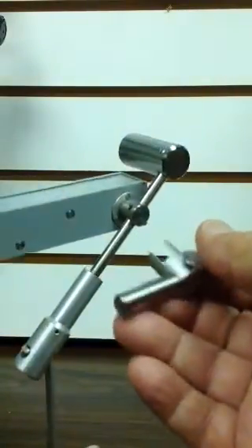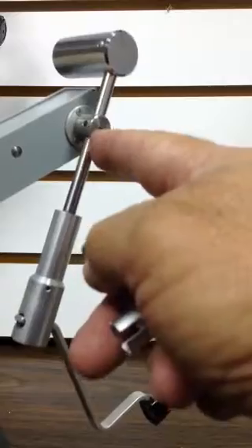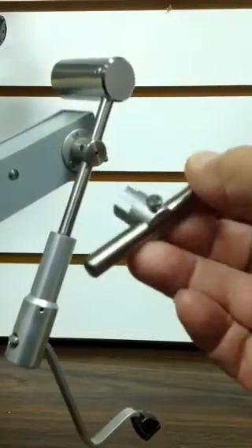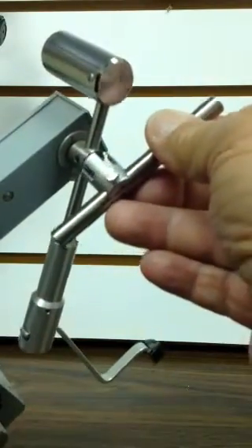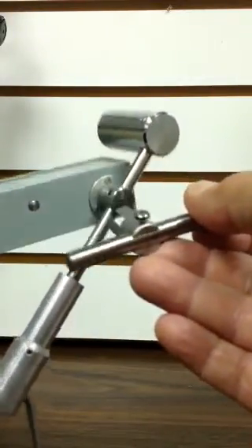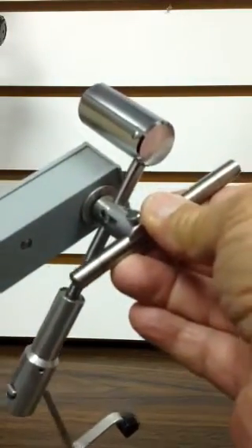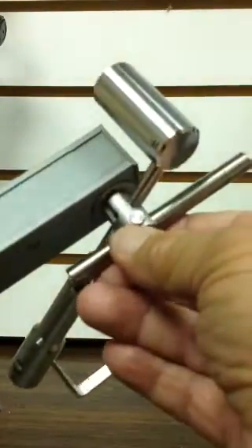If you notice, as I hold this differently, there is the bar here. And if you notice, there are four slots in the block. What I want to do is, keeping the unit and the weights on the same plane as the main tonometer, I want to slide the block over the slots, as you can see.